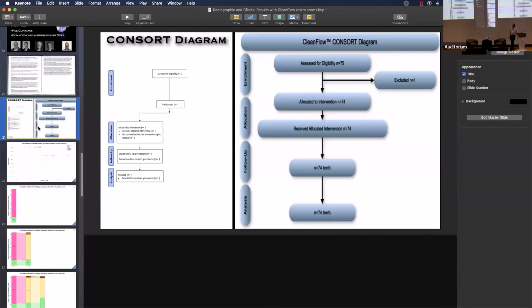Retreatments are almost always multi-visit now. I may run GentleWave if I can't get down the MB2 or something like that, and I still may do multi-visit on that case, and I may follow the case for radiographic evidence of resolution of AP and symptom resolution at 3 and 4 months. So multi-visit is still in my armamentarium. And you're going to have some single visit failures, and I have them too. Most of my single visit failures, and that's what we found in this trial, and Kevin actually called me on this.